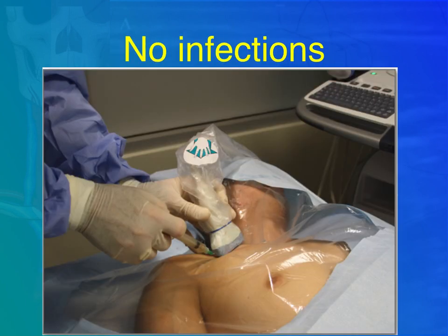The use of the central line bundle is obligatory in the placement of a central line. These bundles contain drapes, ultrasound probe covers, sterile coats, masks, head caps, and can be found in the central line placement cards. Also, you can find all the necessary equipment in the surgical cart that we discussed in the other talk. So, no infections.